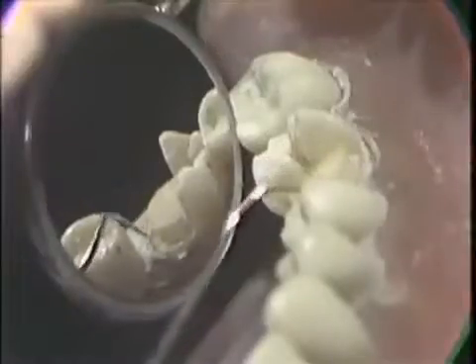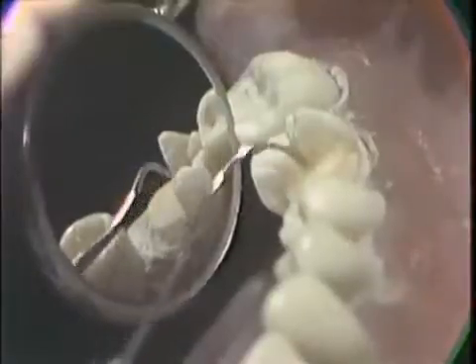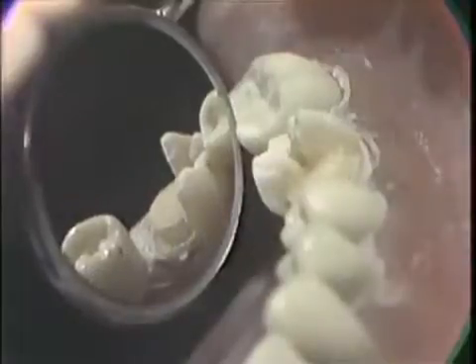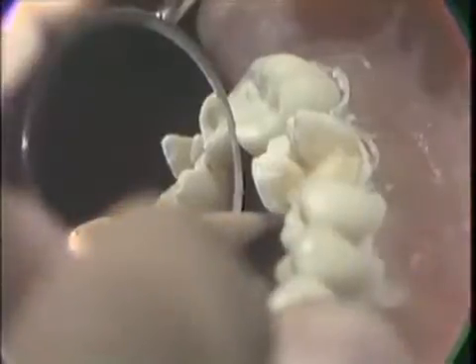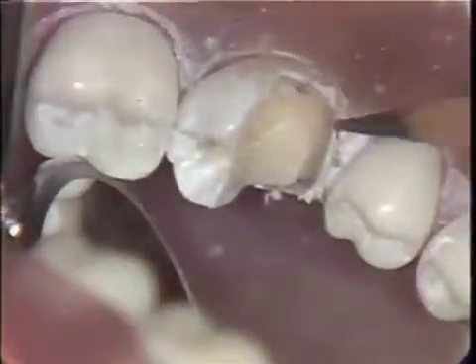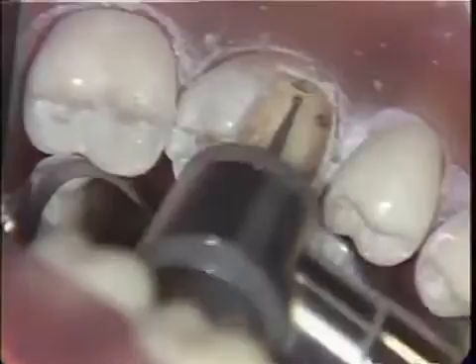We now have a well-developed shoulder and extension into the distal groove of the occlusal surface of the tooth, and the pulp is not exposed. We are now planning the placement of the pin holes and placing four pencil dots where we want to place the pins. The pins cannot penetrate into the pulp of the tooth or run outside of the tooth into the periodontal membrane.